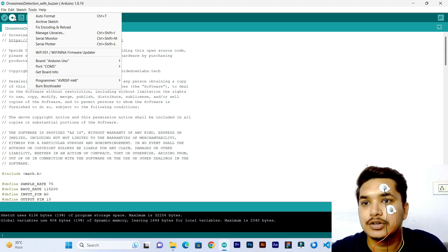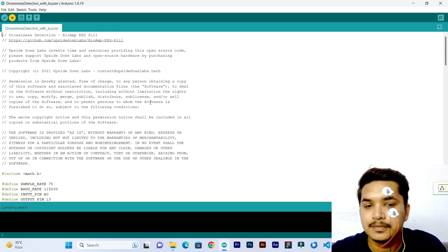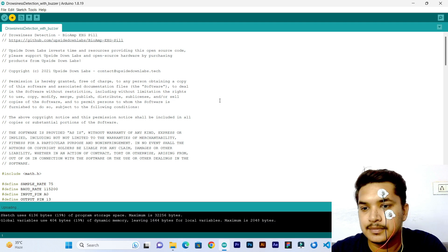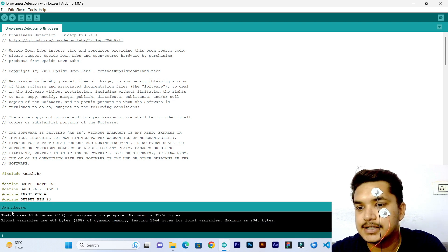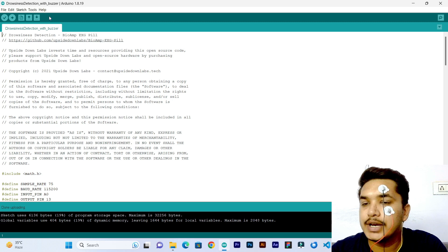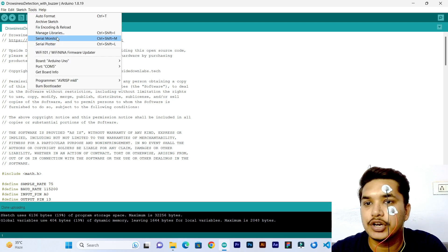Let's upload the code. Now it says done uploading, so we can go ahead. Now let's see what is happening in the serial monitor.